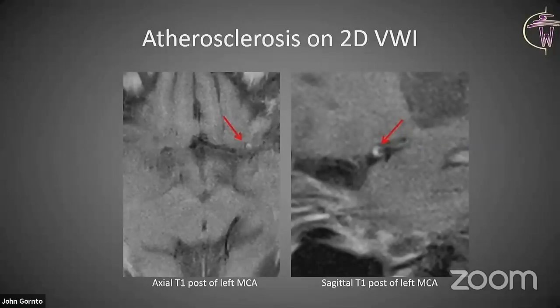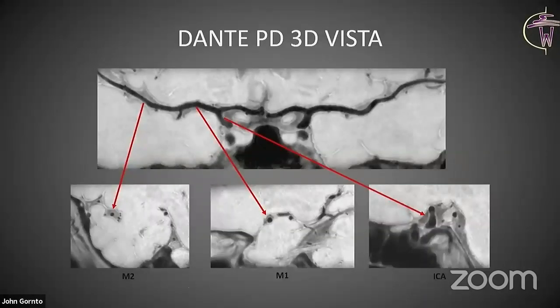Imaging to capture where exactly lesions are. And so in terms of 3D imaging, as I mentioned, you can reconstruct it in any plane you want. And this is an example where we basically flatten the image with a curved planar reformat to look at both MCAs in one image. And then on the lower row, you can really manipulate the imaging to best look at the artery in a perpendicular plane relative to its course.